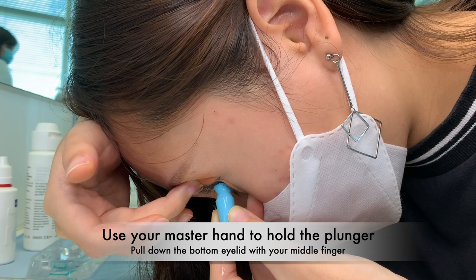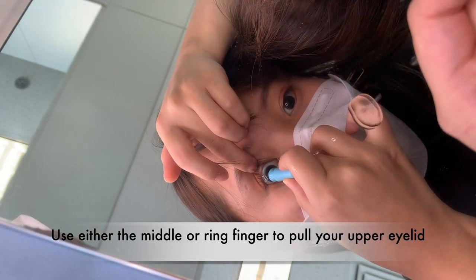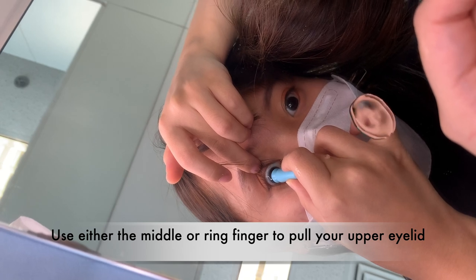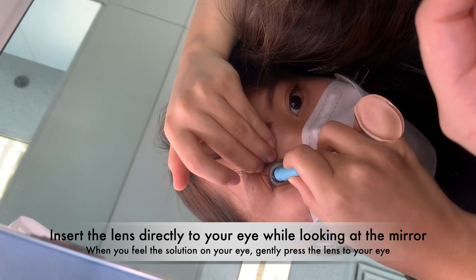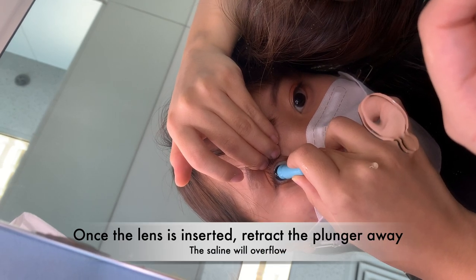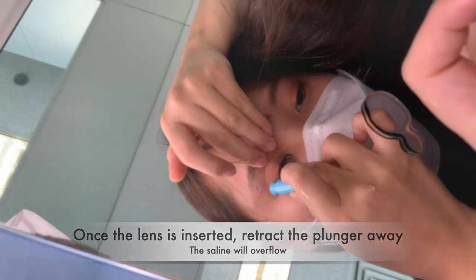Use your master hand to hold the plunger and pull down the bottom eyelid with your middle finger. Use either the middle or ring finger of your other hand to pull up the upper eyelid. Insert the lens directly onto the eye while looking at the mirror, and gently press the lens to your eye. Once the lens is inserted, retract the plunger away and slowly release your eyelid.